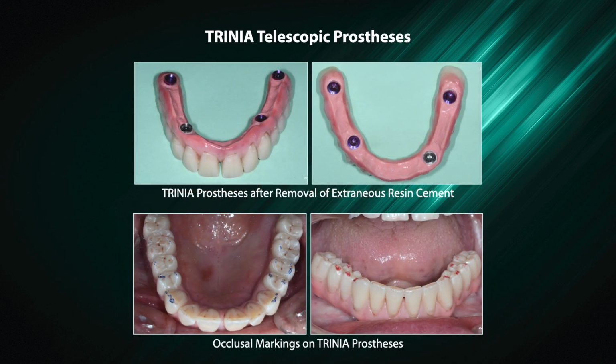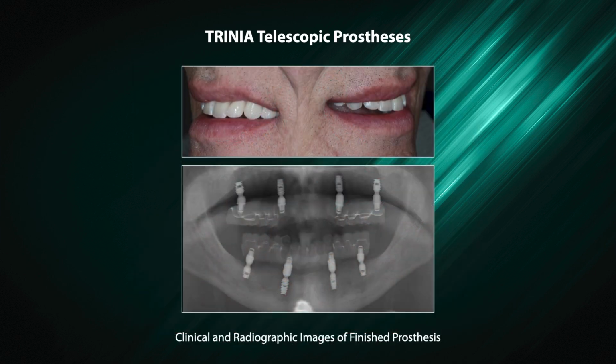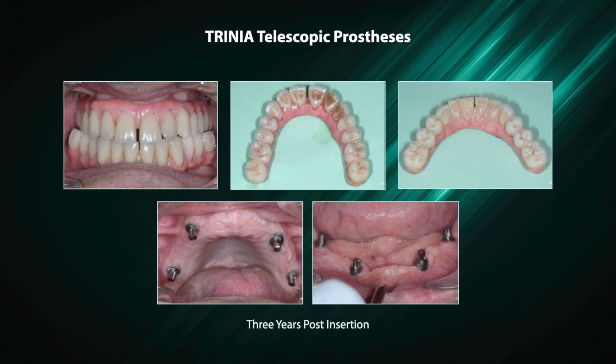Here we can see the TRINIA prosthesis after the removal of extraneous resin cement and occlusal markings on the TRINIA prosthesis. Clinical and radiographic images of the finished prosthesis. 3 years post-insertion.